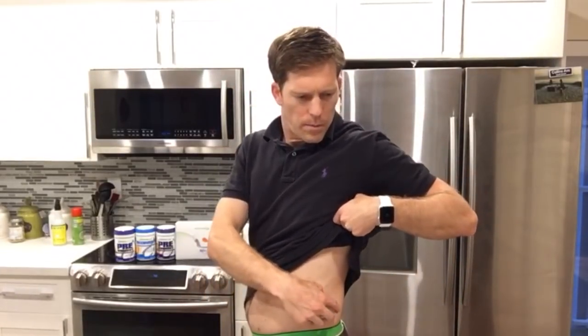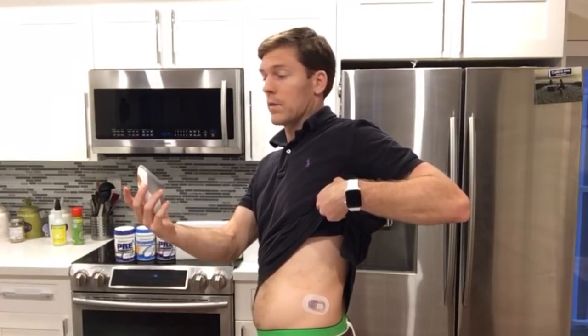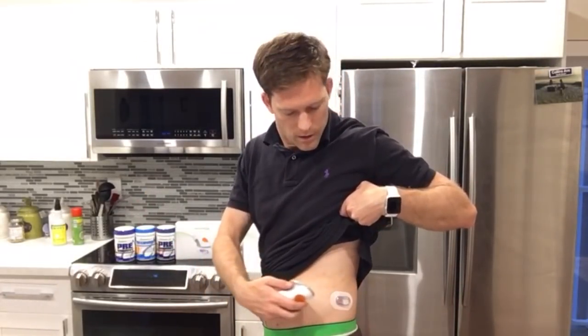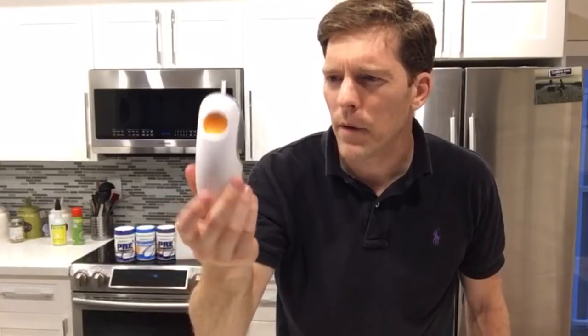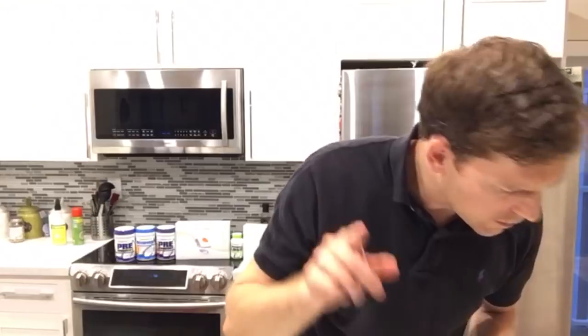Then you press the orange button to insert. Lift that off — that was really painless, actually pretty damn good. I barely felt that. So this is what's left — it's just this big plastic thing, seems like kind of a waste. I'm going to go ahead and recycle this because that's a big piece of plastic. Unfortunately I think there's really no use for it, you just throw it away, but I'm going to recycle this. Hopefully you guys do the same.